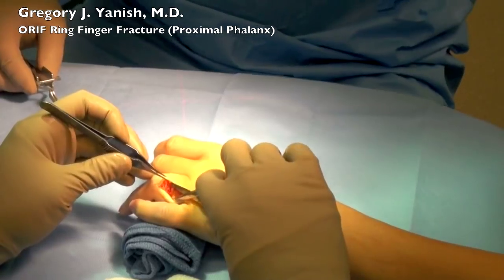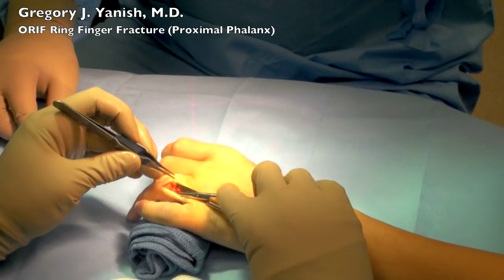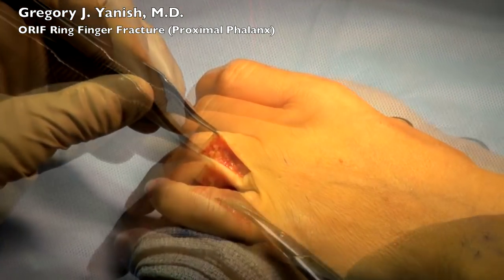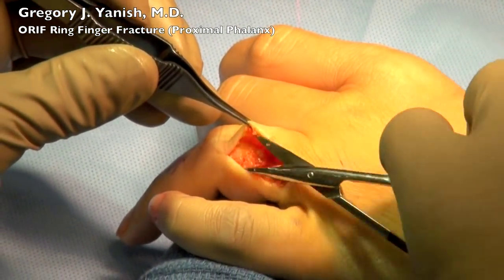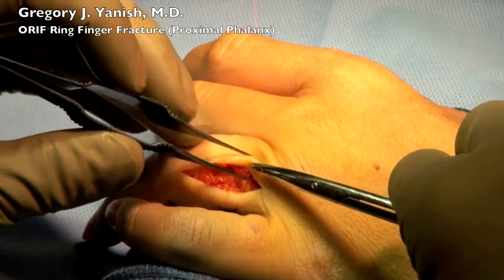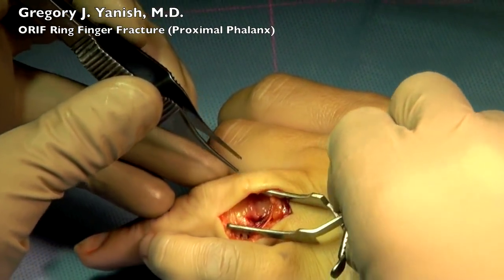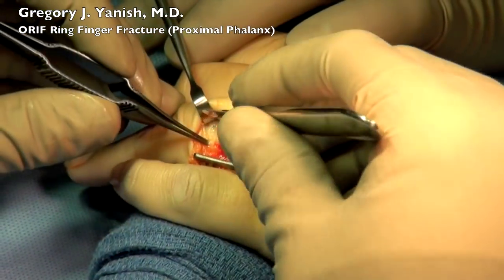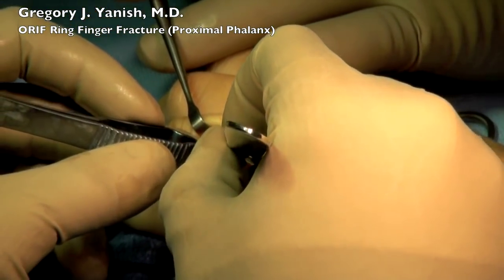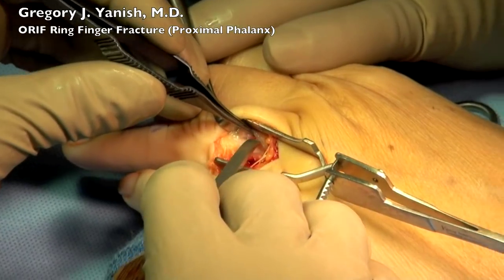Then we dissect down using Littler scissors and forceps to the level of the extensor tendon and the bone. Bipolar cautery is used for some minor cauterization. You can now see the extensor tendon mechanism coming into view, along with a few final blood vessels which we did buzz with the bipolar.